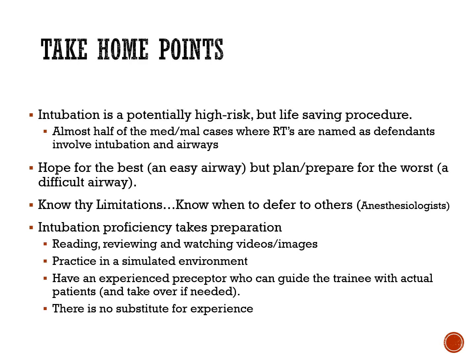So let's take a look at some of the take-home points from this presentation. Intubation is potentially a high-risk but potentially life-saving procedure. Almost half of the med-mal cases where RTs are named as defendants involve intubations and airways. I'm not trying to scare you guys away. It's a high-risk procedure, so it just needs to be done carefully. You need to consider deferring to the anesthesiologist, the physicians, even a fellow RT if you're unable to intubate. Do not let pride get in your way.